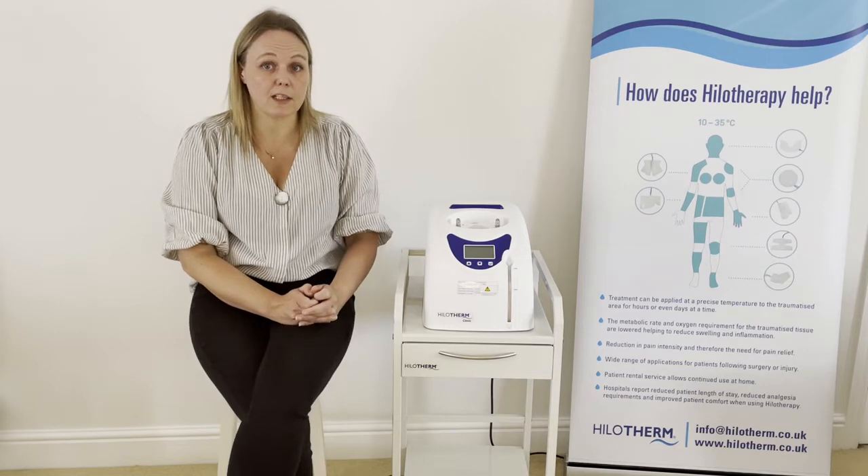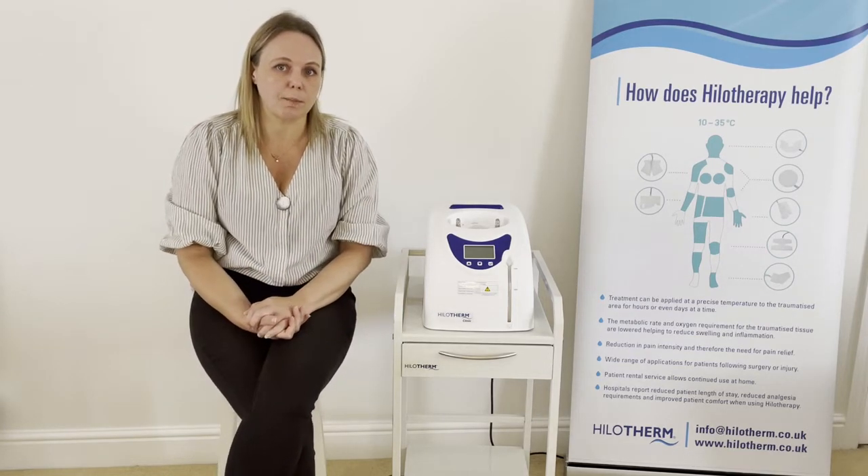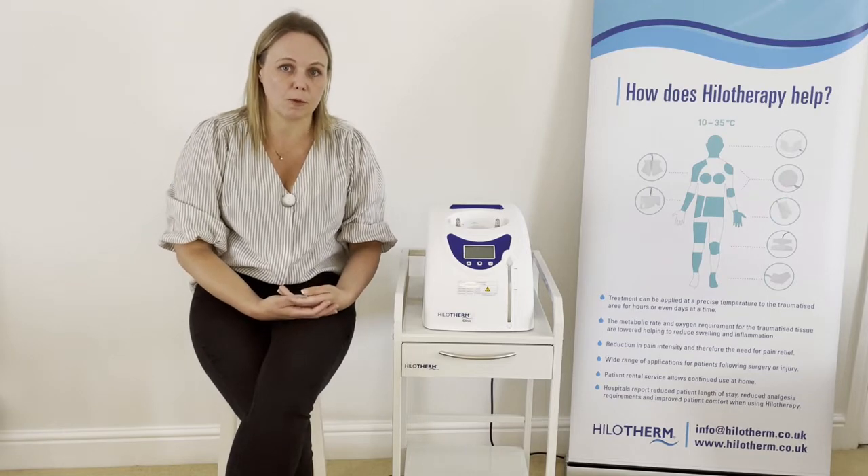Welcome to the user video for the Hilotherm clinic device. Hilotherm is a temperature controlled treatment which is used to reduce pain, swelling and bruising following either surgery or injury. This video is designed for medical professionals who are using Hilotherm with patients in hospital.